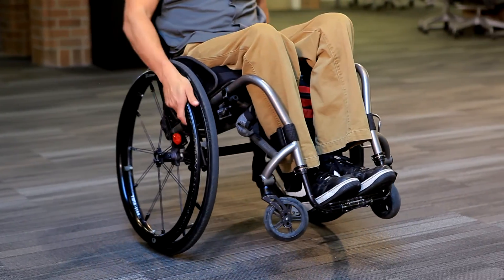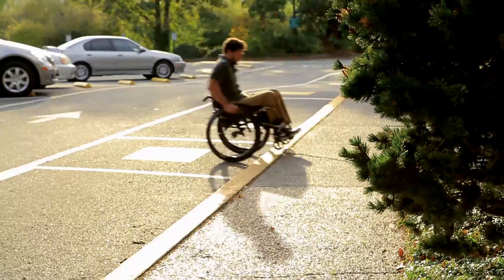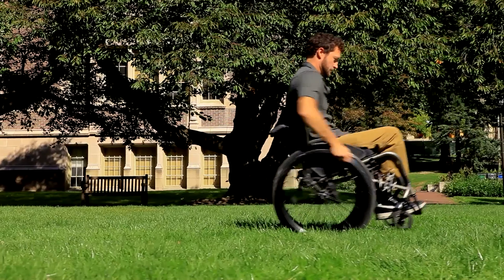If you struggle with this technique, a physical or occupational therapist who is a wheelchair seating specialist may be able to adjust your wheelchair or provide you with wheelie lessons.